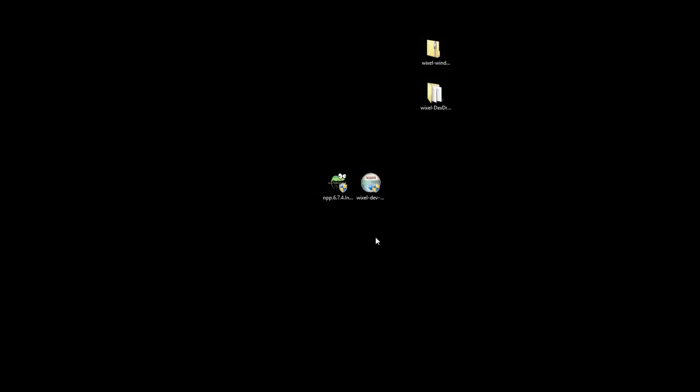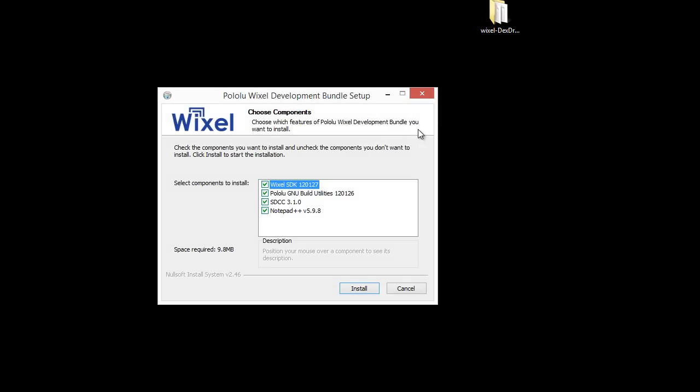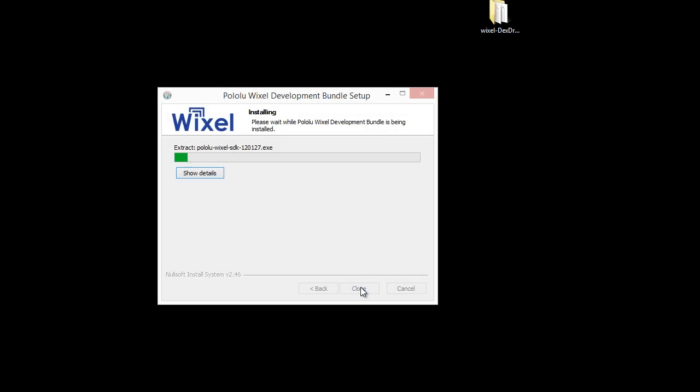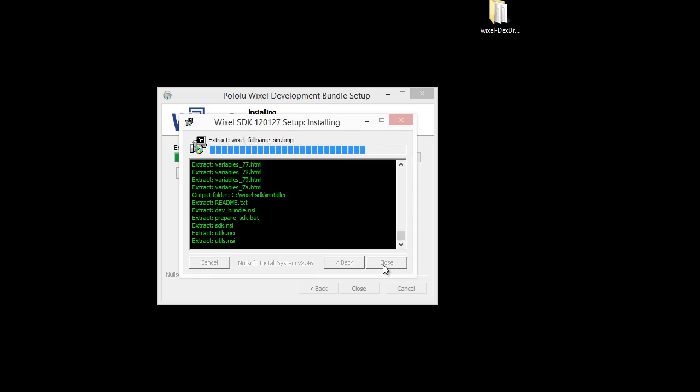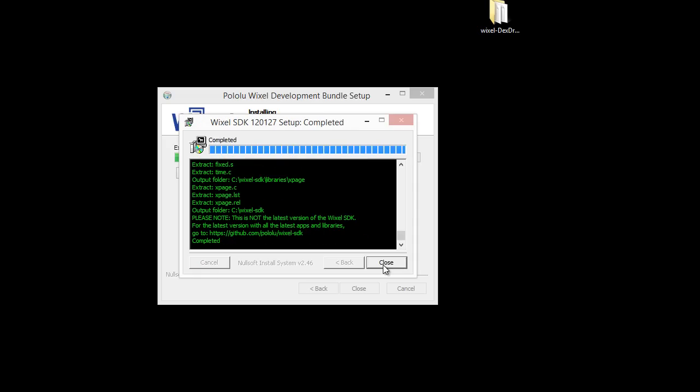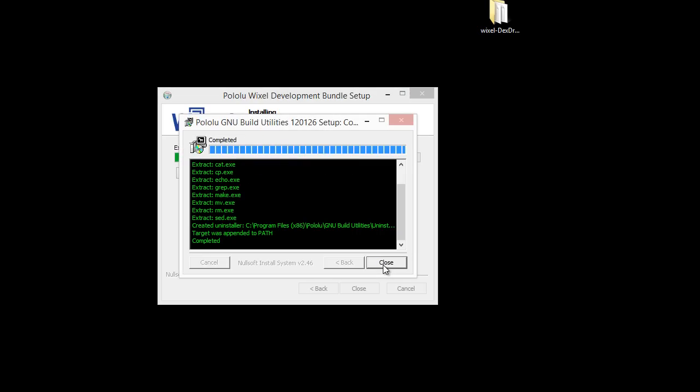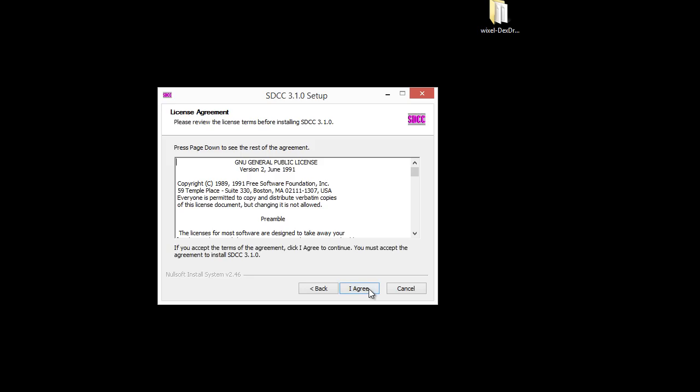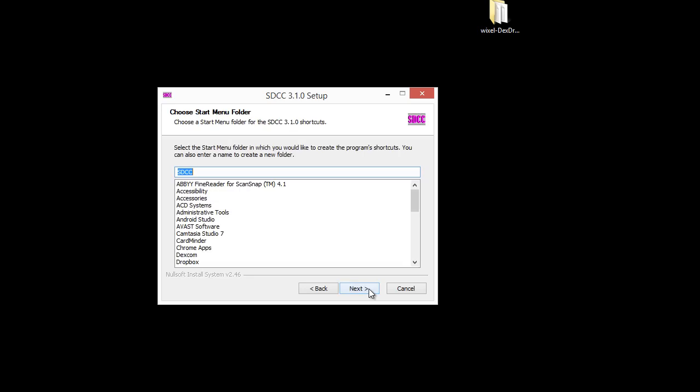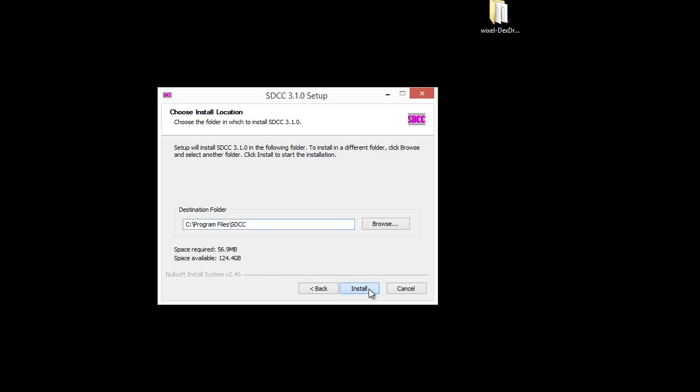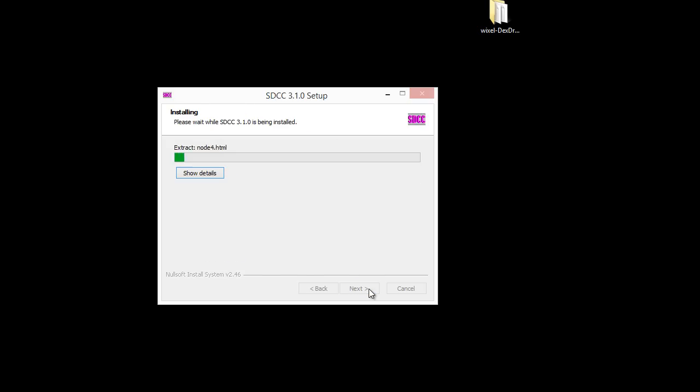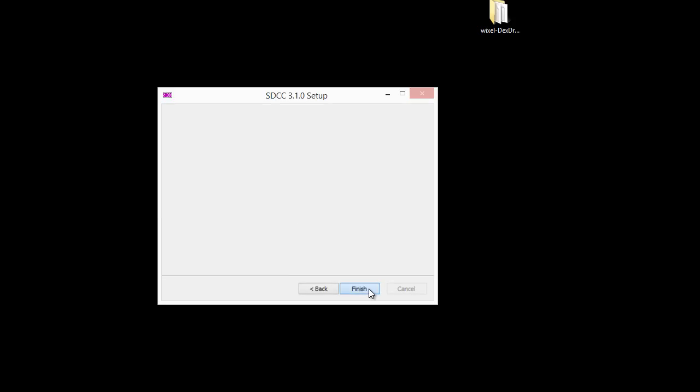Once we've done that we can install it. So double click on that, choose install. And then we'll keep installing through the multiple setup steps. Next, I agree, and install.